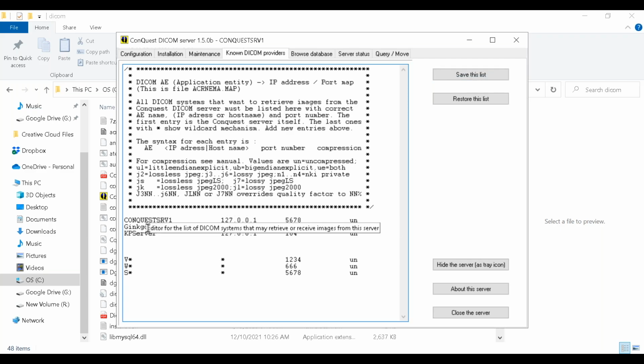Well, let's go to this Ginkgo. I'm going to change this. Well, actually, let's just enter a new Ginkgo. I'm going to give it a name, Ginkgo, because, and I know this because we're going to be creating this software. I'm going to use the tab, and I'm going to go over to an IP. Now, how do I get an IP? Does anyone know that one?